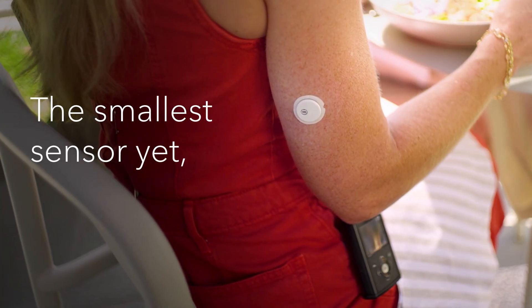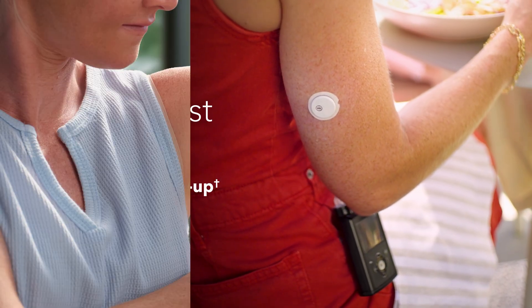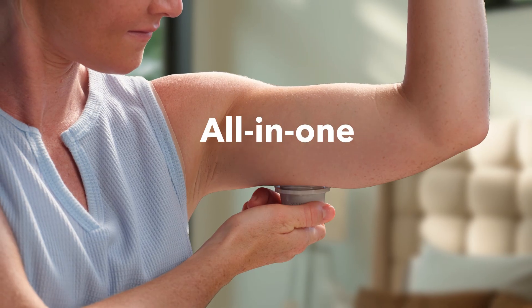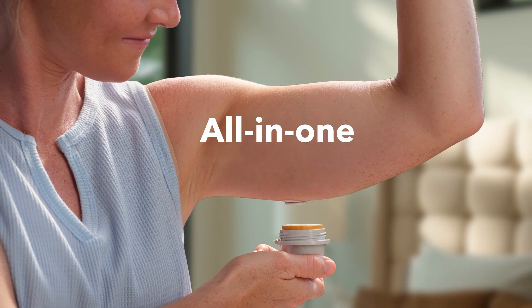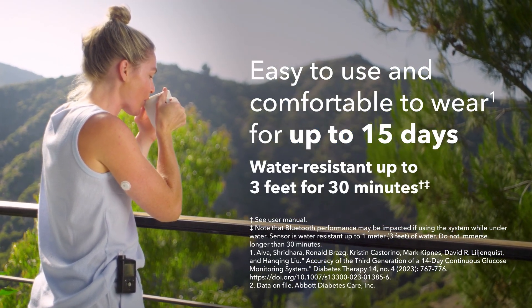The Instinct Sensor is the smallest sensor yet, with a one-hour warm-up, featuring an all-in-one applicator for quick and easy insertion. It's designed for comfort, is water-resistant, and lasts up to 15 days.